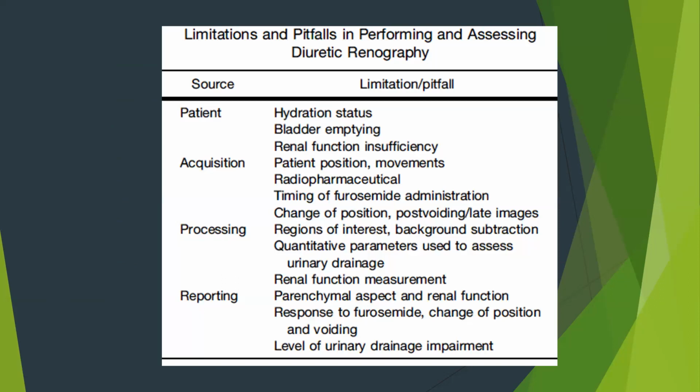But then there are different limitations and pitfalls in performing and assessing the diuretic renography. Most important is the hydration status of the patient, and then renal function insufficiency, also bladder emptiness.